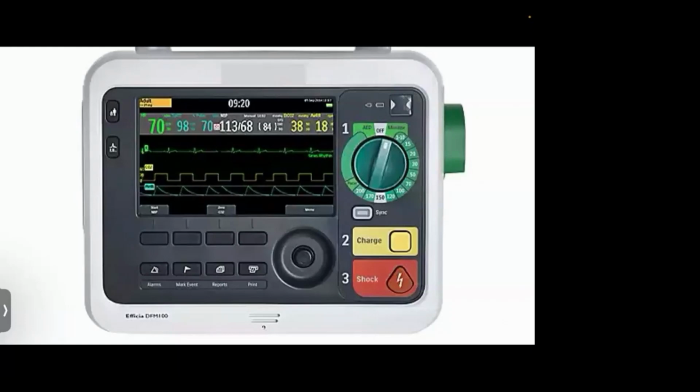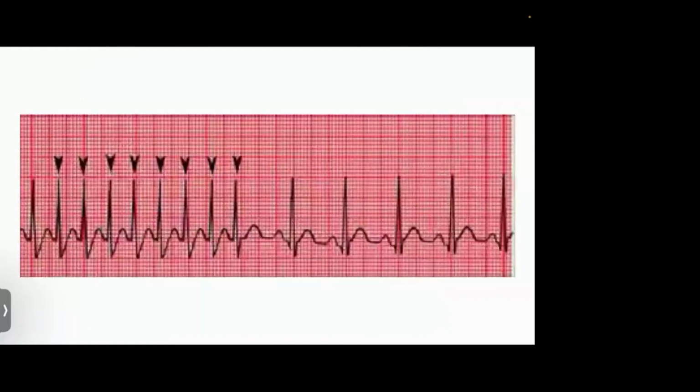And here the monitor is there. The monitor will show you the heart rate, provided you have connected it to the ECG leads. Apart from that, it also shows certain other parameters like the charge delivered, and it shows the action potentials.